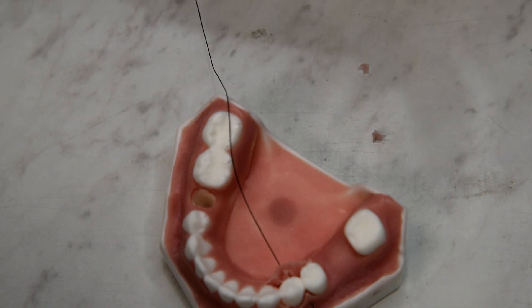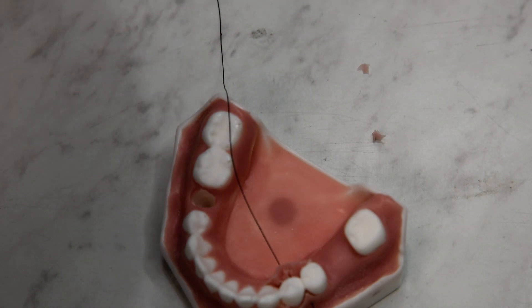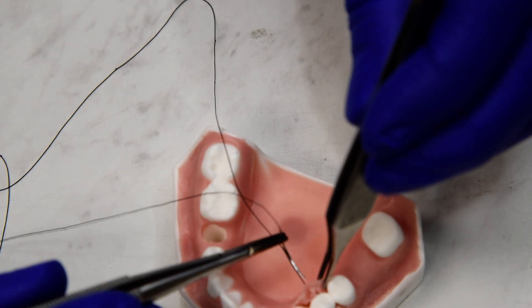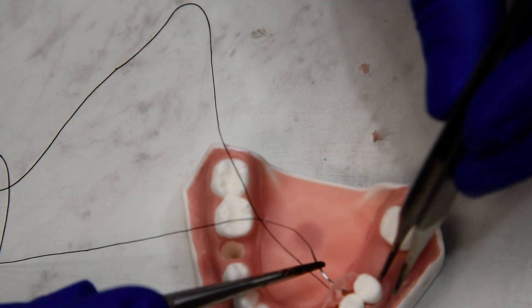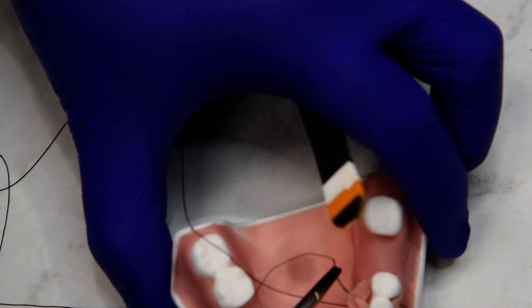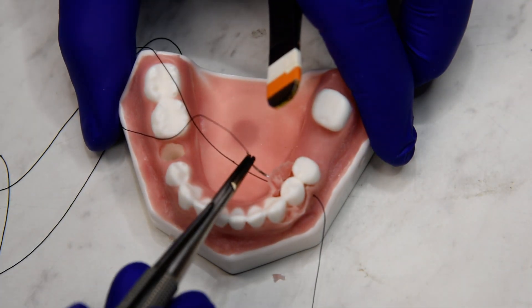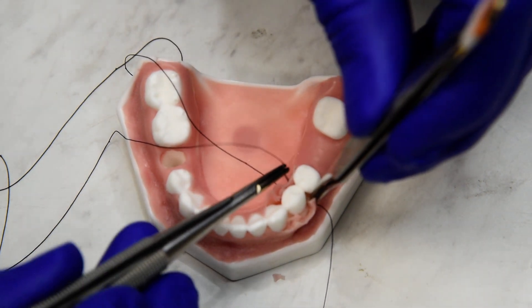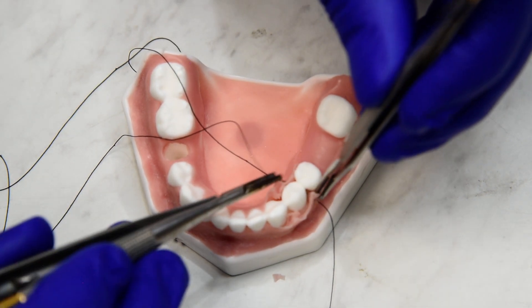And then our third throw is more marginal or more coronal on the papilla and underneath the contact point as well. And we're going to bite, if we can, also here on the way through, more marginal.